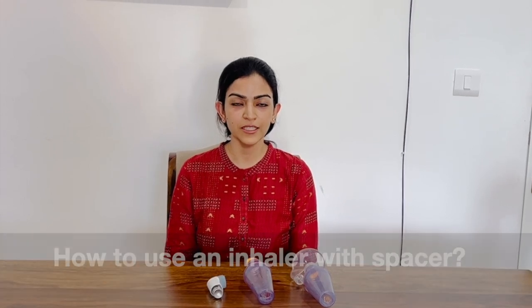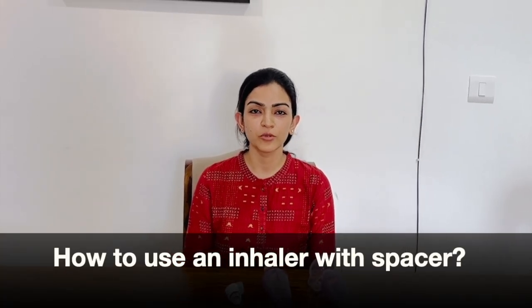Hello friends, I am Dr. Anshula Kayal Bansal. I am a consultant pediatric pulmonologist, and in this video I am going to demonstrate to you how to use an inhaler.